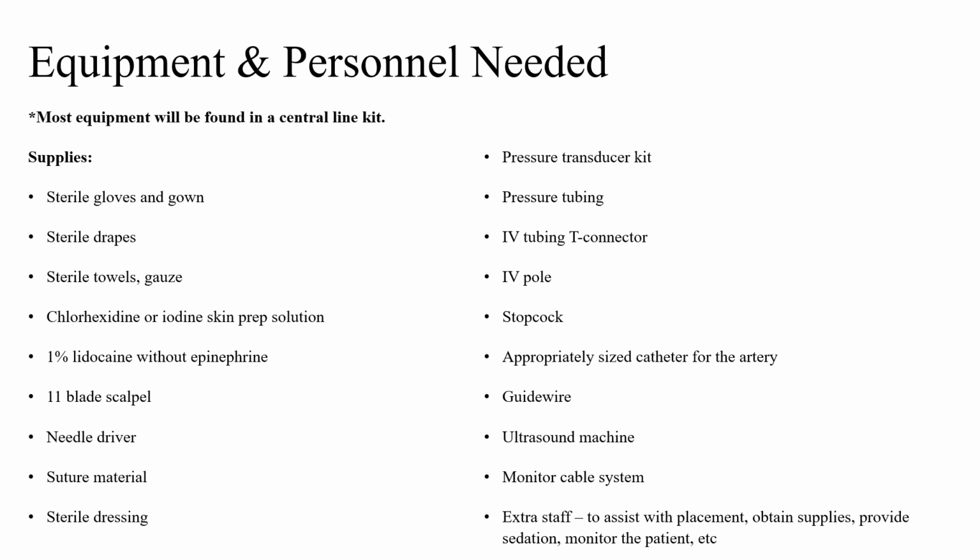Just because if you're going to be handling things, all of these instruments and equipment will be on a sterile field. So be prepared to be sterile if you're going to be assisting. Otherwise, it's a good idea to just have people in the room to provide some extra sets of hands, especially if you have to give some sedation medications and monitor the patient.